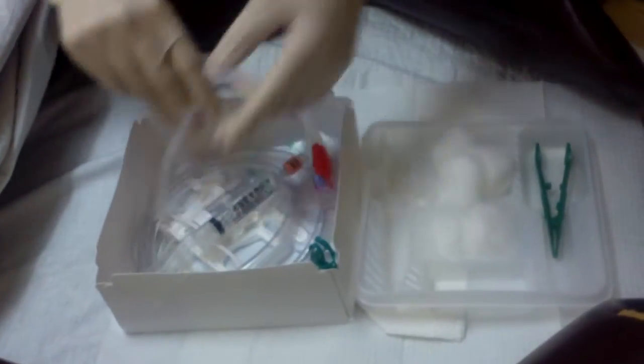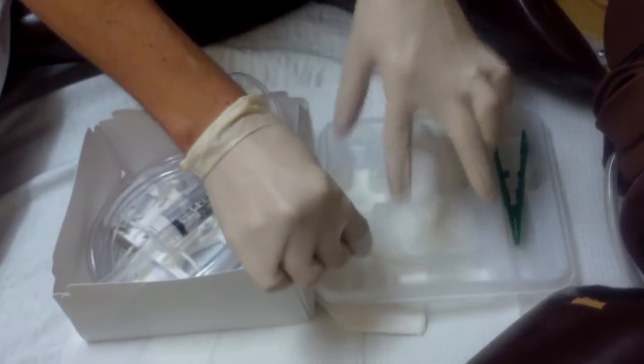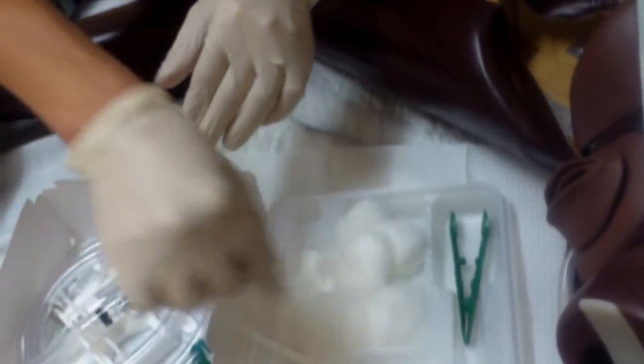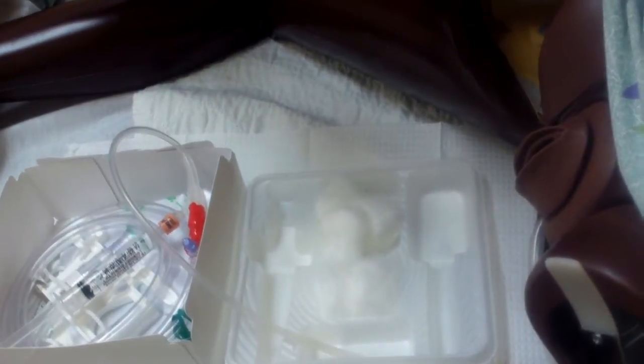Now once I have everything, I need to find my catheter. I'm going to lubricate the 2 inches on the tip there. All right, and I'm just gonna kind of set that in there. That should stay because it is stuck. Okay, now that I have my iodine and my cotton balls, I'm gonna use my forceps.